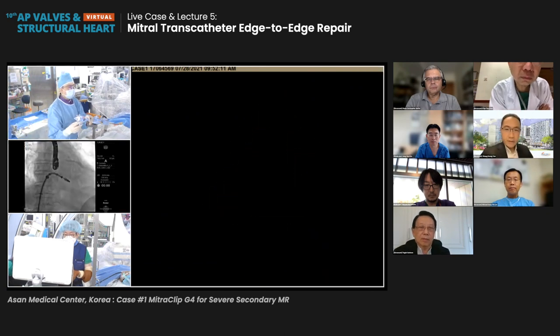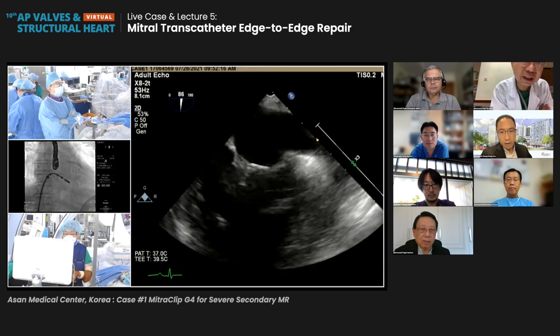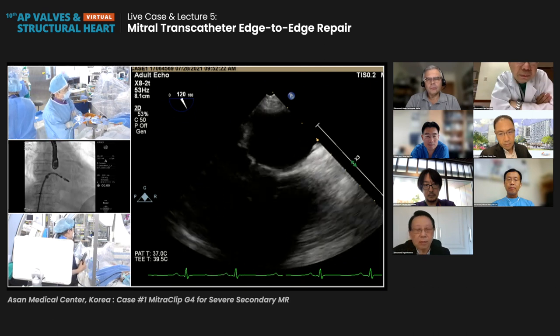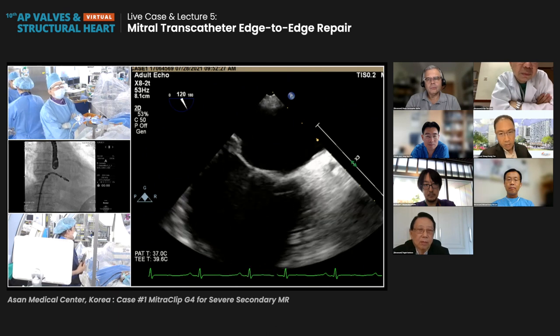What's the gradient? The gradient is 2. Just 1? Yeah, 1. I think I'll put another NTW. You want to put another NTW? Doctor, you recommend the NTW? Yeah. And Dr. Kim's opinion is XTW. Let's hear both.